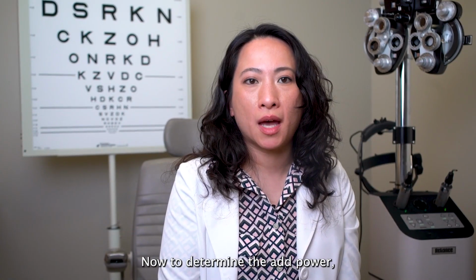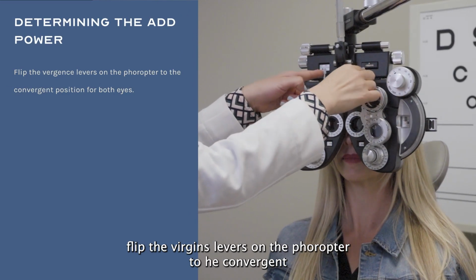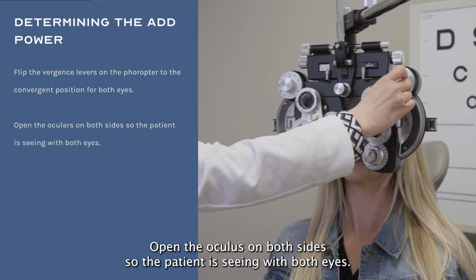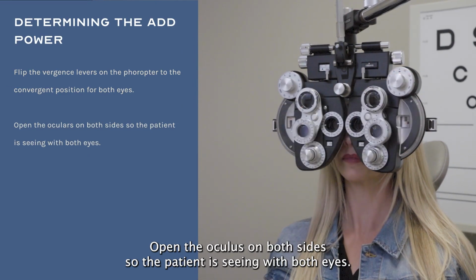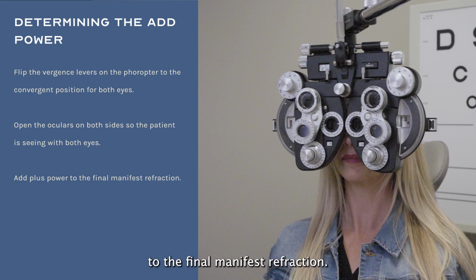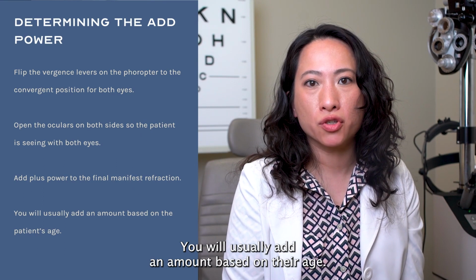Now, to determine the add power. Flip the Vergence levers on the phoropter to the convergent position for both eyes. Open the oculars on both sides so the patient is seeing with both eyes. Add plus power to the final manifest refraction. You will usually add an amount based on their age.